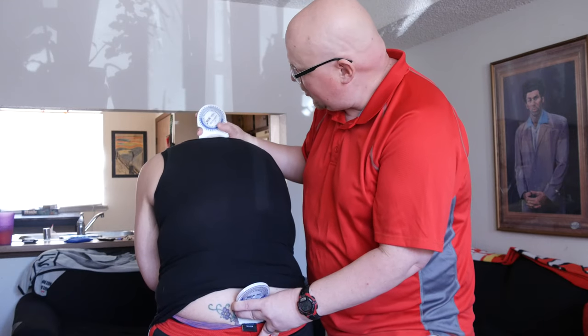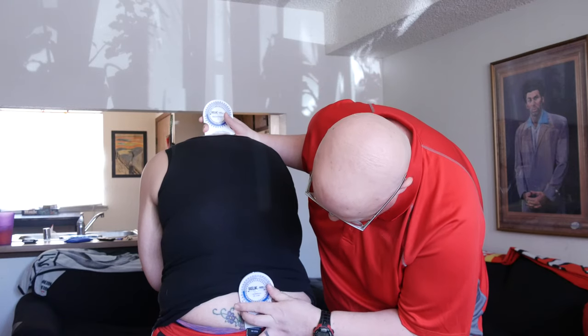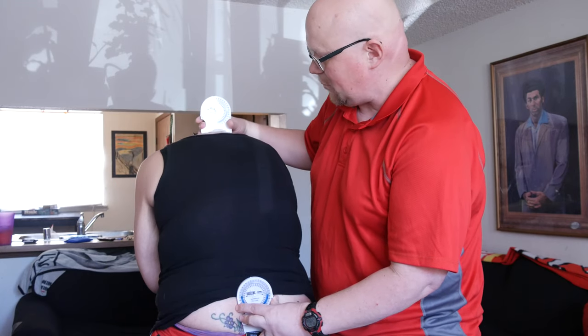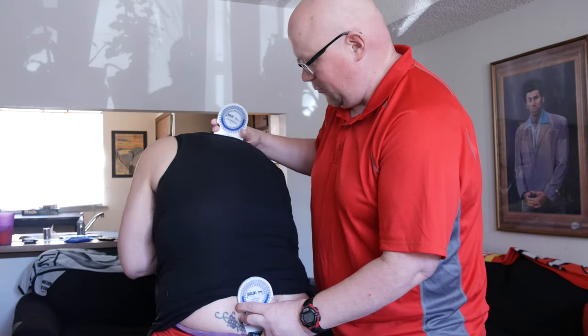Once you get them in that position, you're going to make sure that they're zeroed out from there, and then you're going to have them rotate as much as they can, just in the spinal areas. Try and turn your body for me.